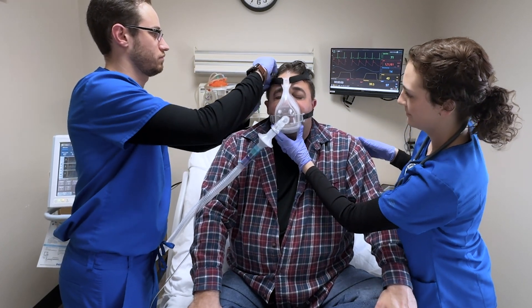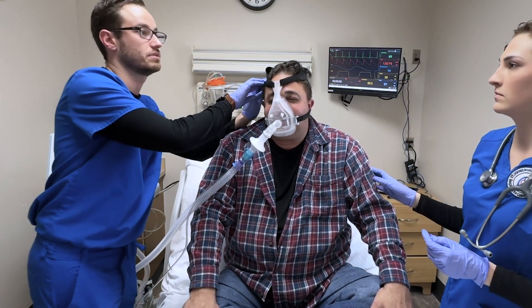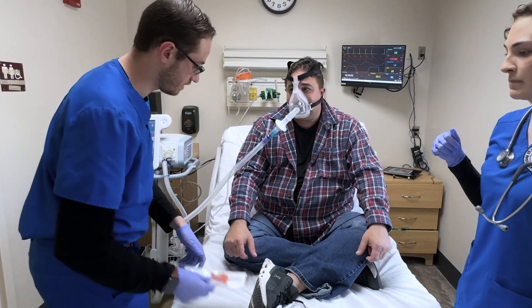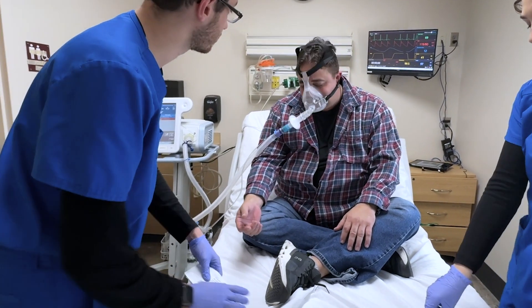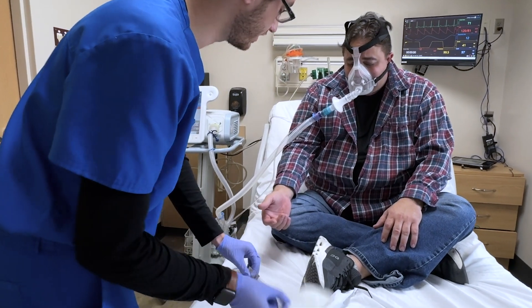How does that feel? It feels good. Alright, I think we need to check his acid-base balance. Okay, let's go ahead and get that. Alright, Mr. Anderson, I'm going to get a blood gas on you, okay? So I'm going to stick your radial artery. It's a little different than what the nurses do — they stick your veins. This is going to be an arterial stick. It's going to give us an accurate oxygen count, okay?